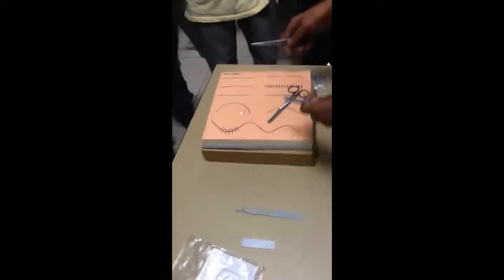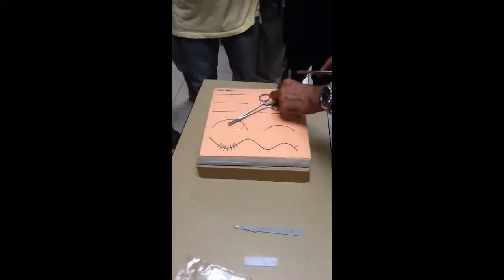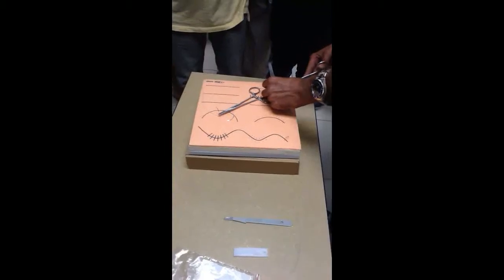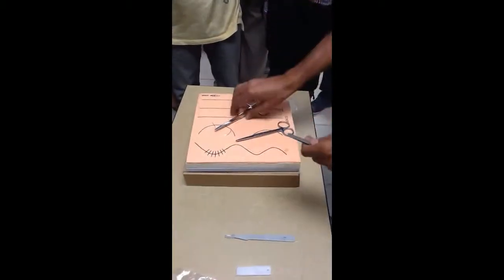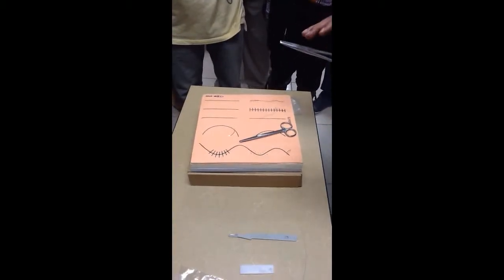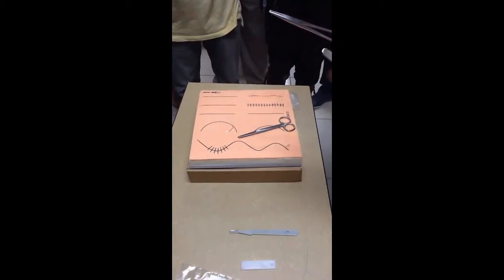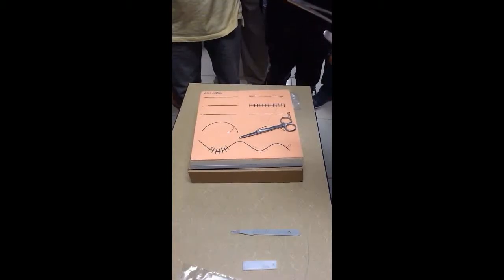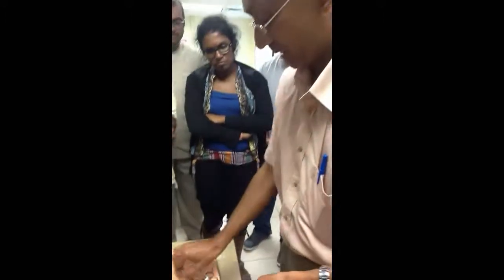Though this is a skin mimic, we usually use this continuous technique — as shown in the second video — on the linea alba. After you've done a laparotomy and completed whatever procedure needs to be done inside, first you have to close the linea alba.